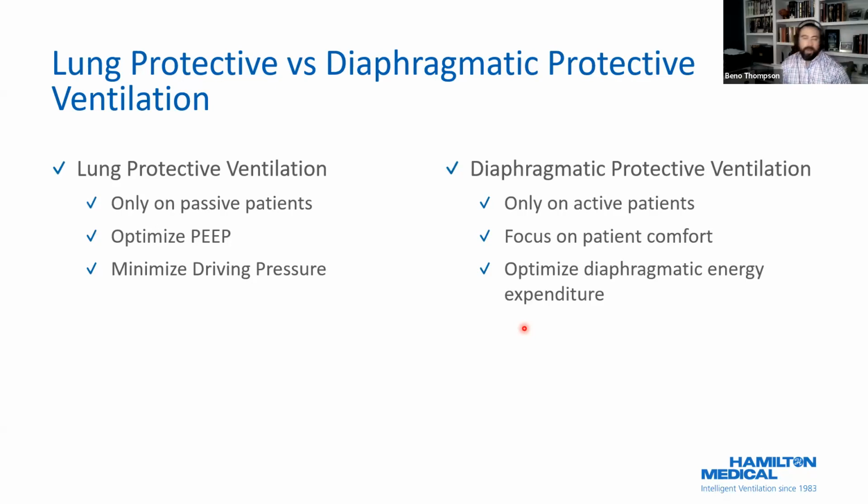It's the first thing you learn about when you learn about ventilation in school. And pretty much every patient you round on, lung protective ventilation is brought up at some point during their ventilatory course. But diaphragmatic protective ventilation, not many people have heard of that. It's a fairly new concept. And it's based on a lot of literature that's been coming out in probably the past 5 to 10 years.